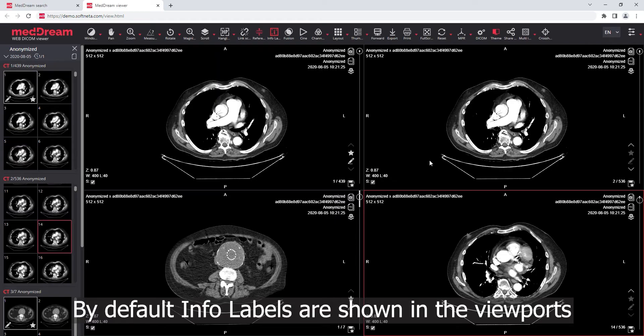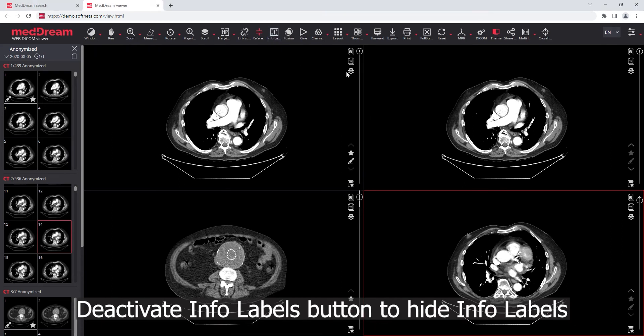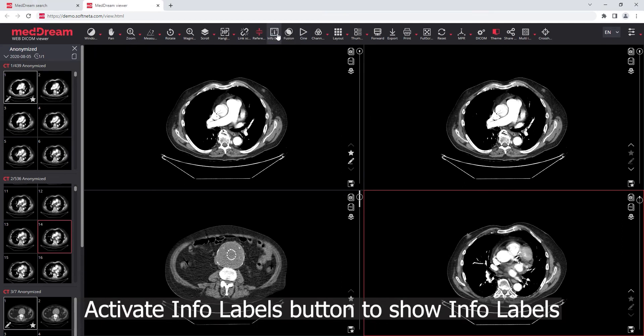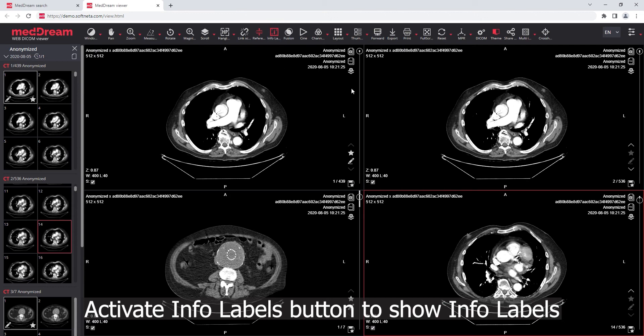By default, Info Labels are shown in the viewports. Press the Deactivate Info Labels button to hide Info Labels. Activate it again to show Info Labels.